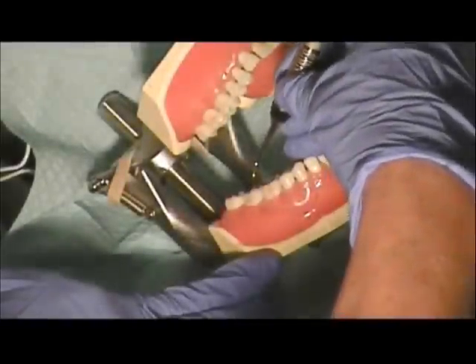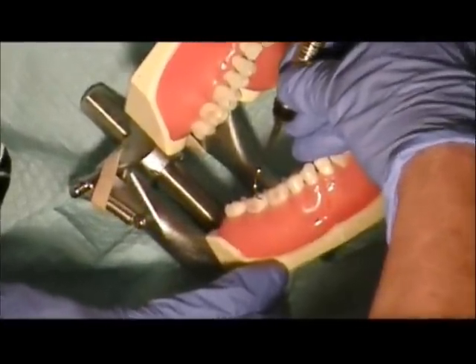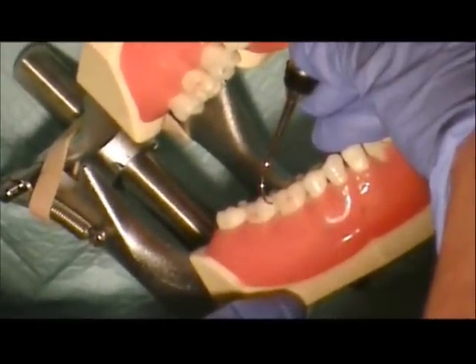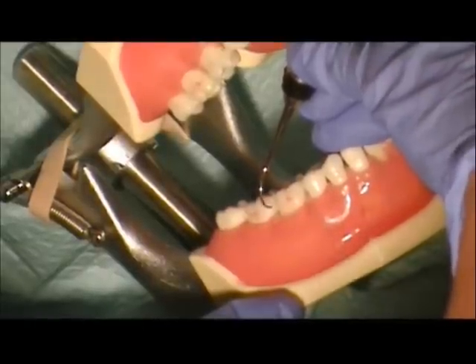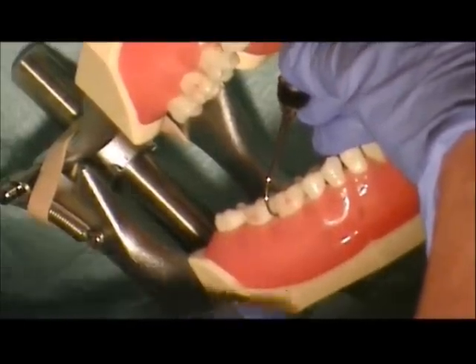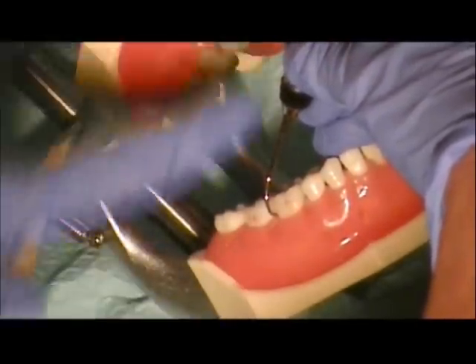The Teri-Sickle is a supra-gingival instrument. It is a universal instrument, so it does not have the offset blade. The face is at a 90-degree angle to the tooth. To determine the correct working end, we'll use the tip of the toe, place it approximately with the terminal shank lined up to the long axis of the tooth, and the handle is coming out of the mouth nicely.